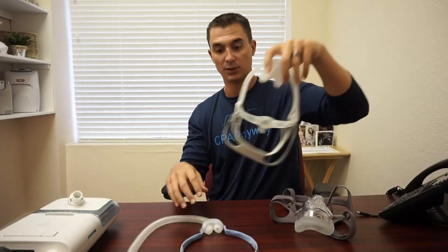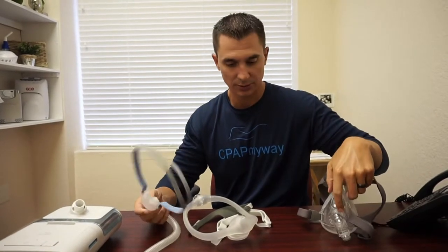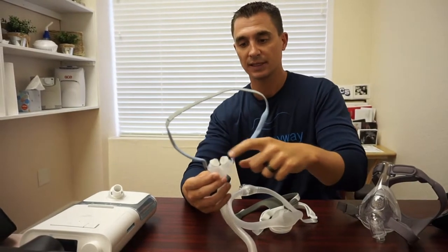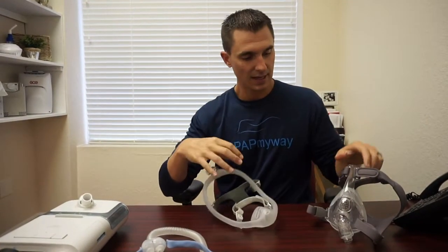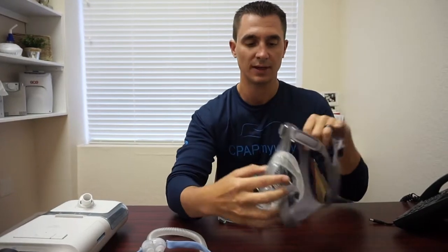Moving on to the masks — the masks themselves all have parts that need to be washed and maintained. I've got the three general types of masks represented here. This is the P10, which is a pillow mask — you notice the two little nasal buds. The Dream Wisp, which is a nasal mask — you notice it goes over the nose. And then the Simplus, which is a full face mask — you notice it goes over the mouth and nose.